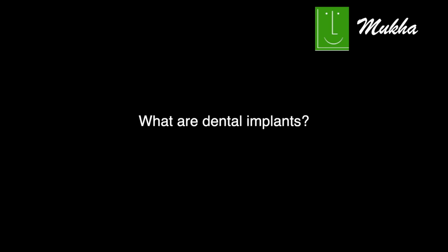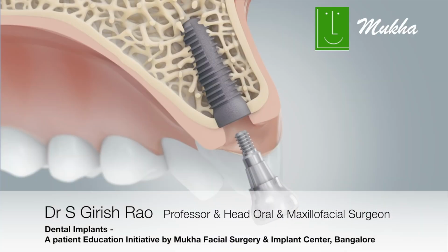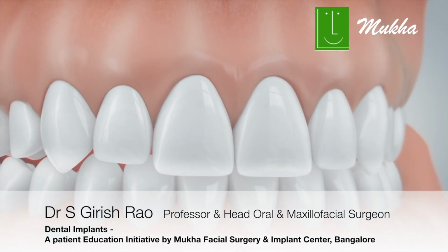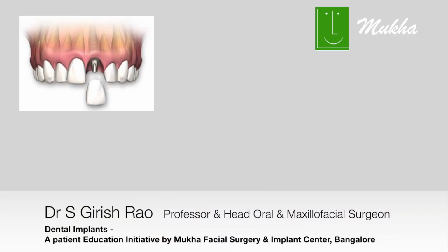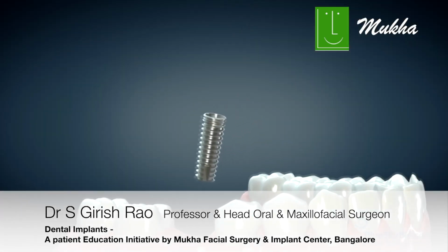What are dental implants? Dental implants are screws made of titanium, which is revolutionizing the way in which tooth replacement is being carried out today. When a tooth is missing, or multiple teeth are missing, or all your teeth are missing, what we can do is we can fix these screws into the bone, the jaw bones, and these anchor your prosthesis.